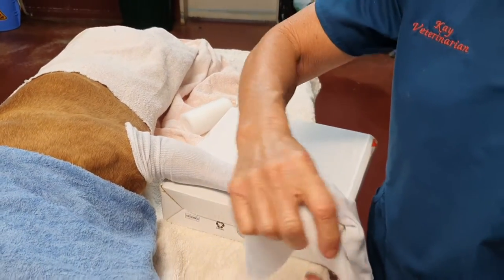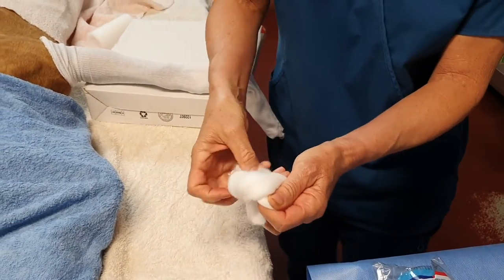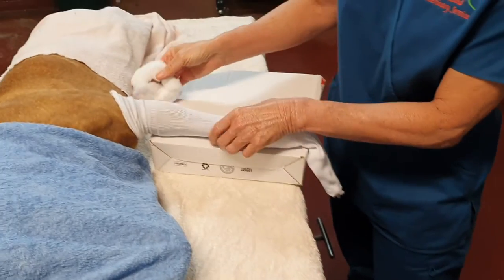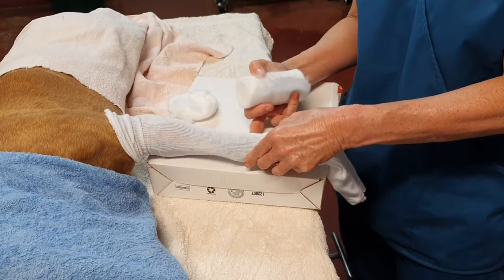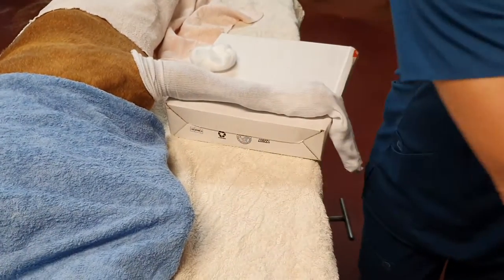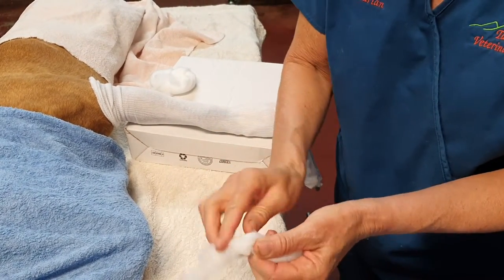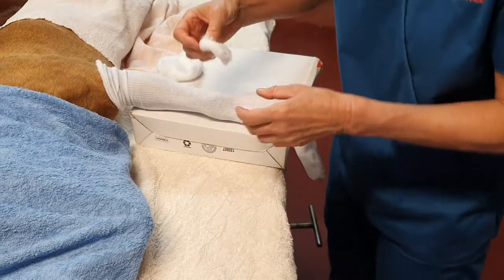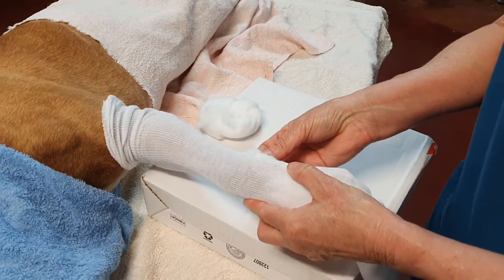Before we do anything, let's put doughnuts on the protuberances. So I've just got a length of soft band, tying it into a knot and just keep going round and round to make a nice sort of doughnut. I'm going to be putting that around the elbow to try and avoid pressure sores at the elbow. I'm also going to be putting one around the stopper pad — it's another area that will sometimes get into trouble with pressure sores. A bandage is not without complications. Dogs can get pressure sores. I have seen dogs lose their legs as a result of either a poorly applied or poorly maintained bandage. So attention to these details and avoiding pressure sores is important. I've just put that doughnut around the stopper pad at the back of this dog's leg.